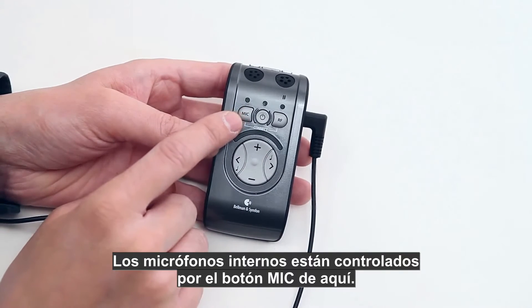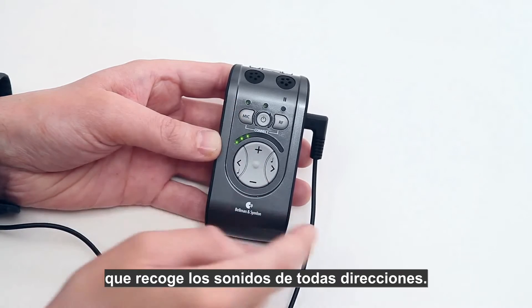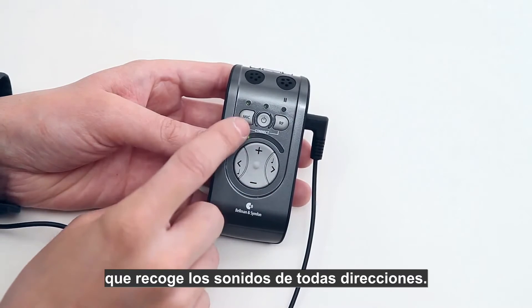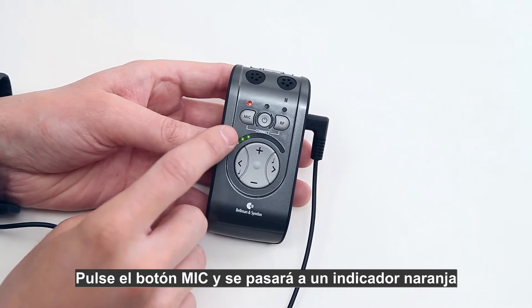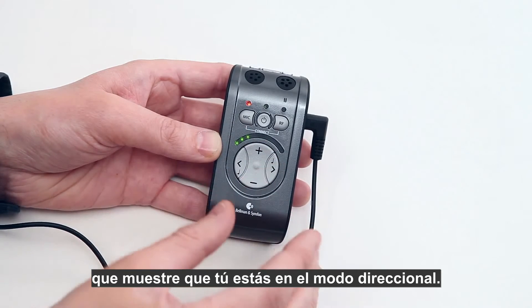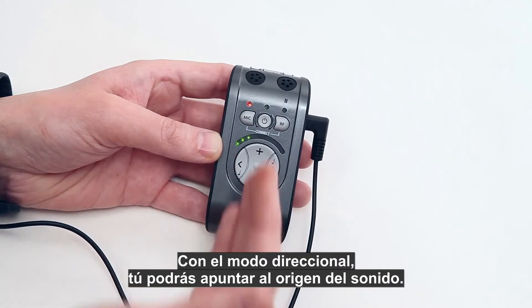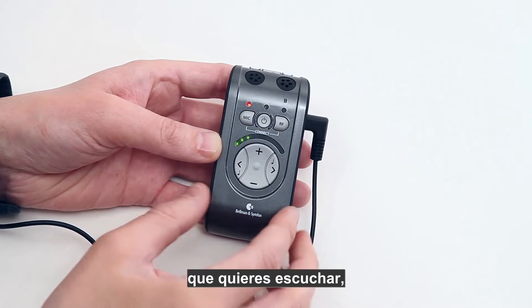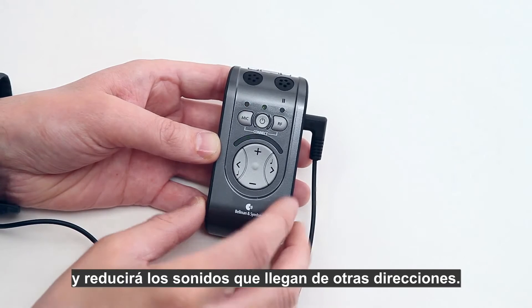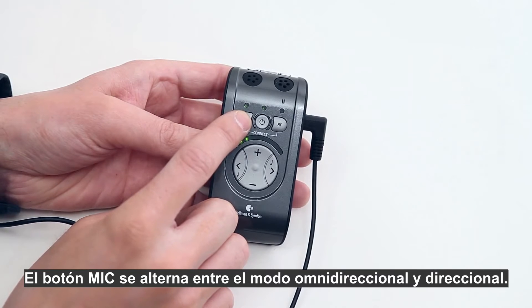The internal microphones are controlled by the mic button. A green indicator shows that you are in omnidirectional setting, which picks up sound from all directions. Press the mic button and it will switch to an orange indicator, showing that you are in directional setting. With the directional setting you can point to the sound source you want to listen to, and it will dampen sounds from other directions. The mic button toggles between omnidirectional and directional settings.